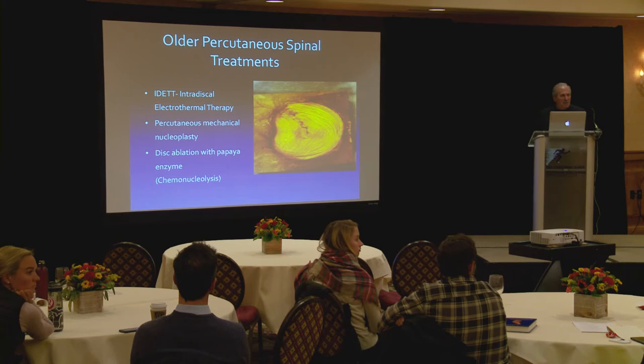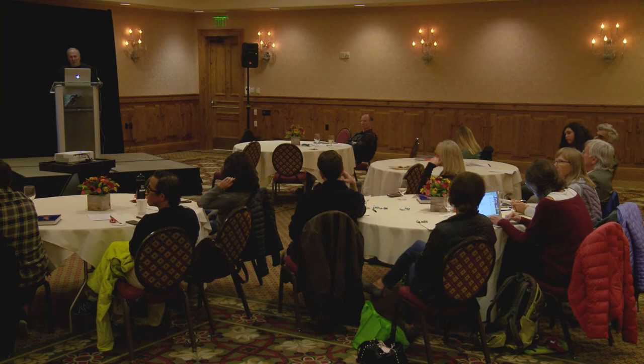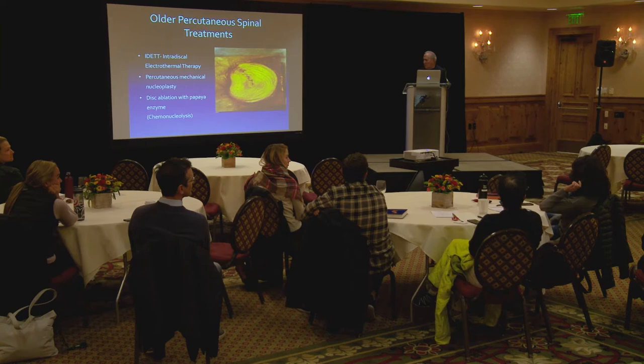Well, the way the anatomy works is that in the lumbar spine, it comes in from the level above and the level below. So if you have an L5-S1 radiofrequency ablation, you have to do L5 and S1, correct? Yeah, I mean, usually we try and just target the one level that's most problematic. Oh, okay. Because I've heard some people say 2 levels above and below, but yeah.